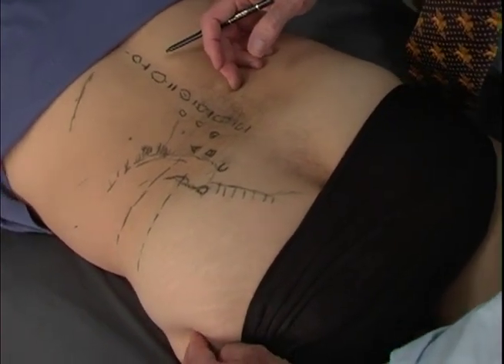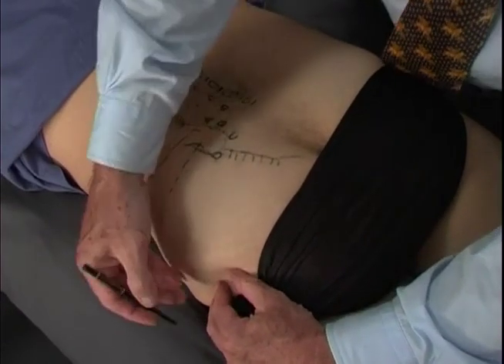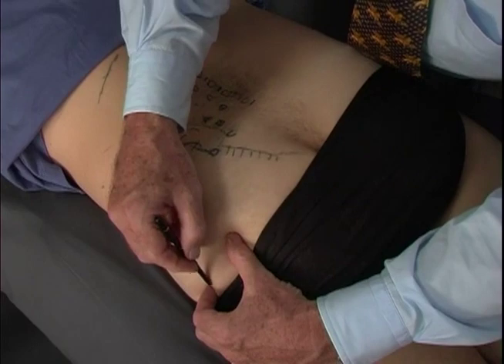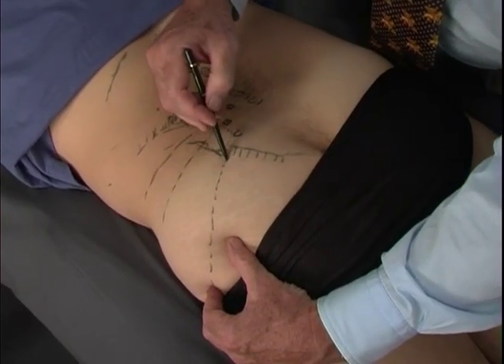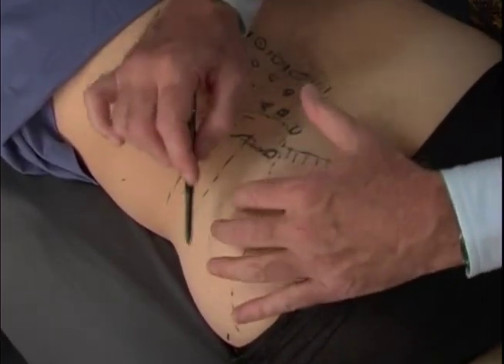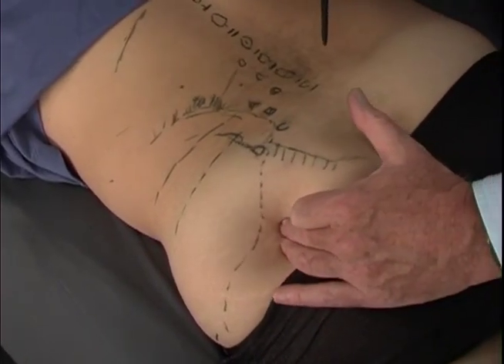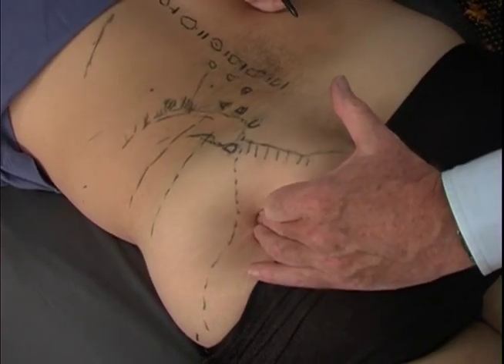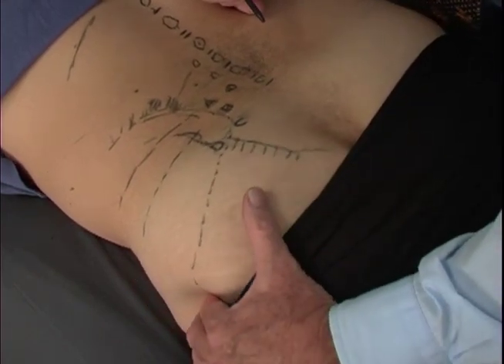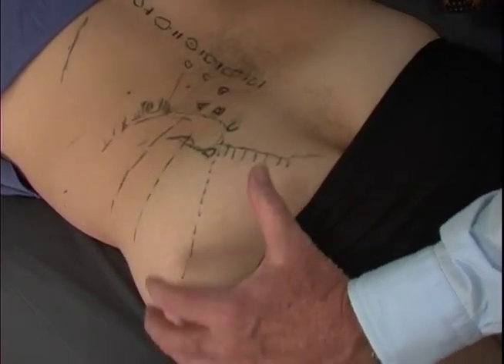When we come down to the trochanter, we want to palpate the top of the trochanter on the side here, and we know from that area up to the bottom of the PSIS, anything above that area is going to be bone and safe to stick our needles in. Below this area, we of course run into the space here where the sciatic nerve comes through, but it's very hard to hit the sciatic nerve, and if you do hit it with a needle, people will tell you about it. But this is a safety feature to stay above this line with your injections when you're doing this particular area.